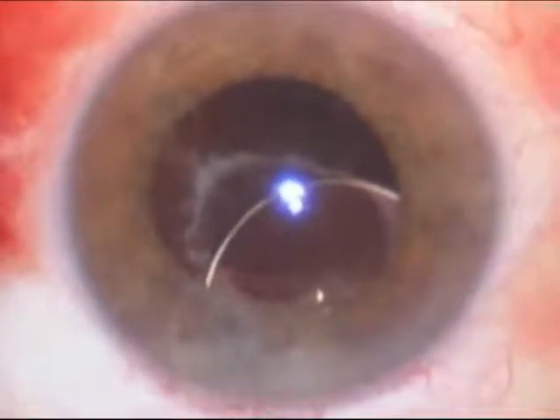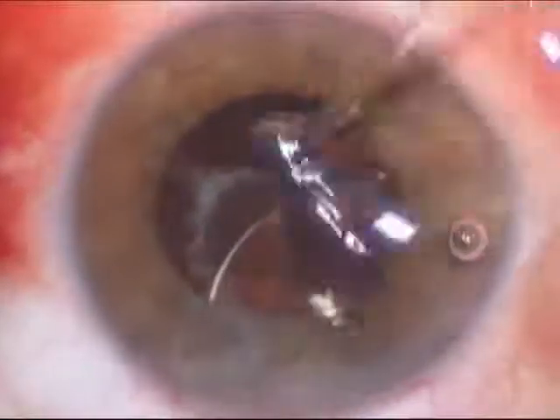As you can see, the visual axis of the eye is not through the lens, and because of that the patient has poor vision.